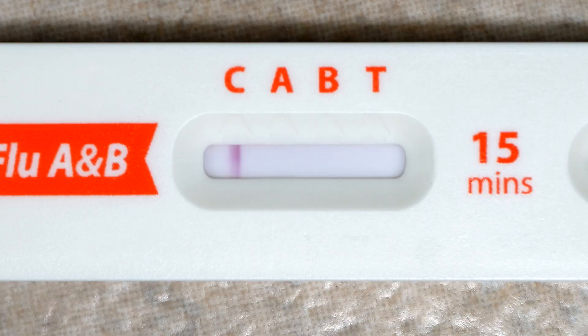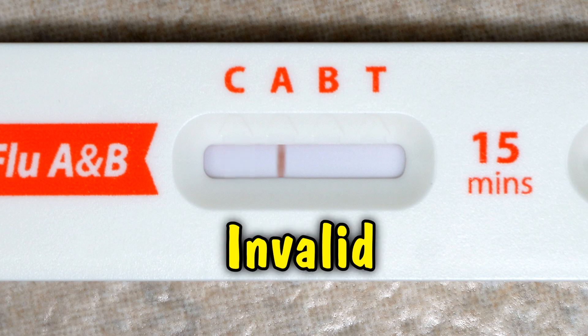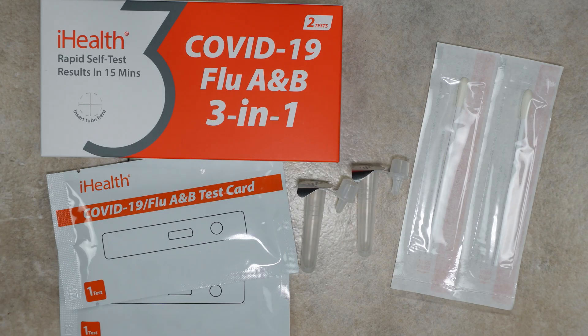After the time is up, look at this window here — here's how to read the results. You have the letters C, A, B, and T, and each one of those could have a line underneath it. The line under the C is just an indication as to whether or not the test worked. If there's no line under C, then the test is invalid and you have to take the test again. Don't reuse the same equipment that you just used.